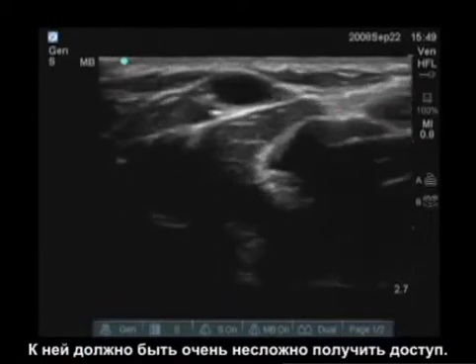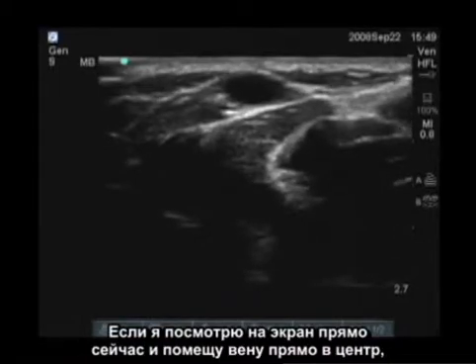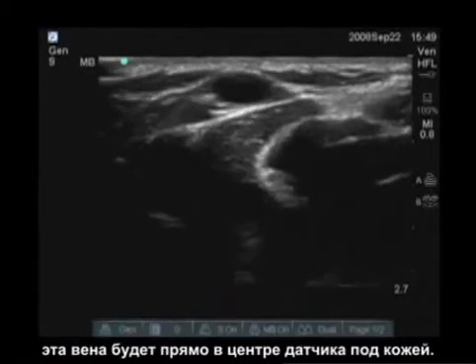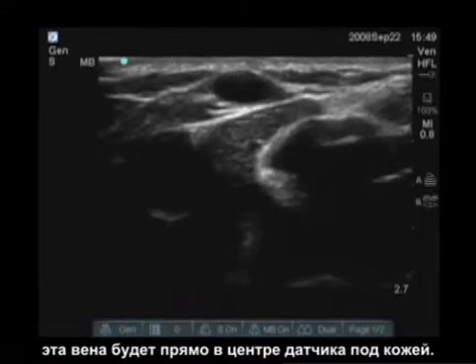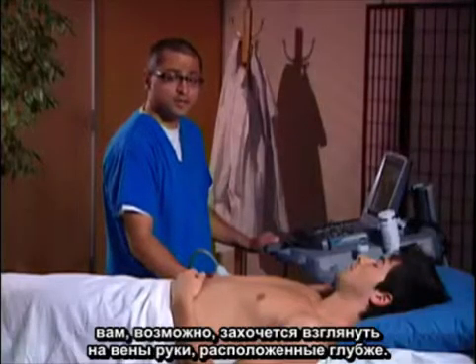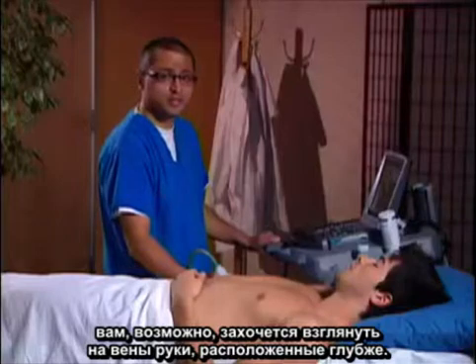So it would be very easy to access. If I'm looking at the screen right now and I put the vein directly in the center, that vein will be directly in the center of the transducer below the skin. If you cannot find anything in the antecubital veins, you may want to take a look at the deeper veins of the arm.